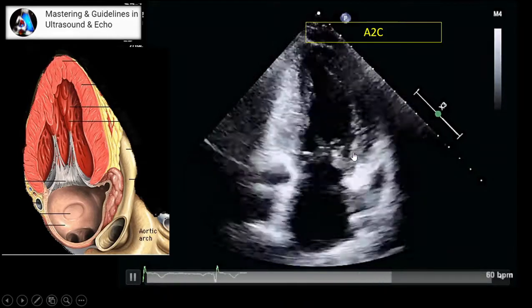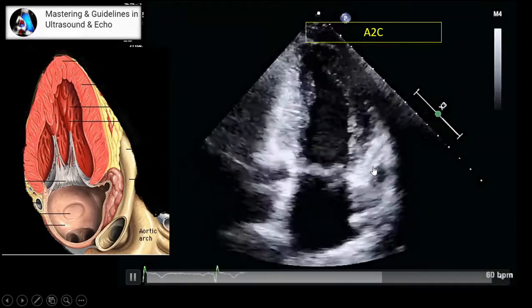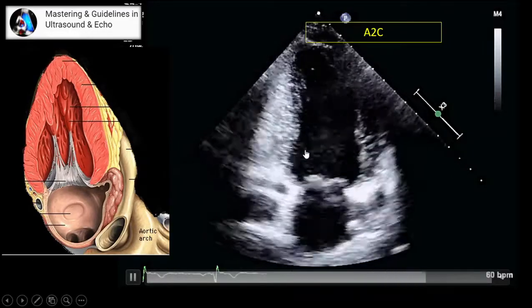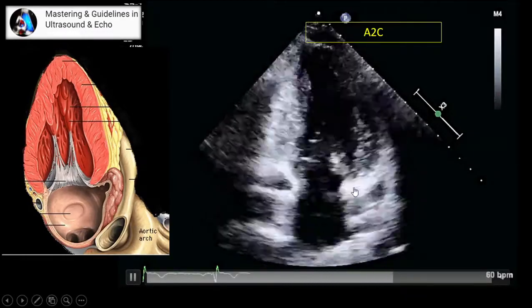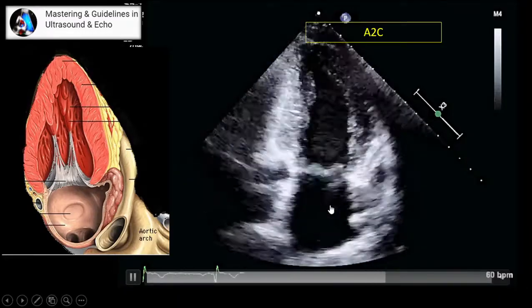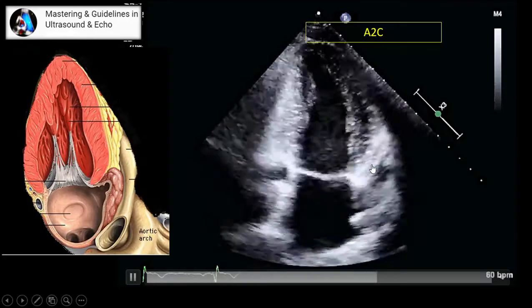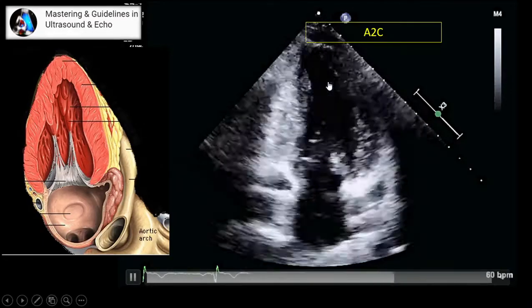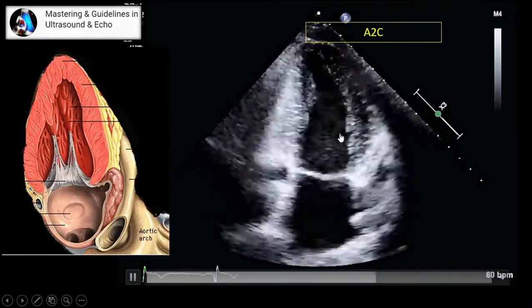During twisting, if you notice the aorta show up, you are fanning to the medial or your left side. In that case, just fan the opposite way and continue twisting. The point is that during twisting, you have to keep the left atrium open and not showing the aorta until you twist 80 to 90 degrees, and you will see very clearly without the aorta.